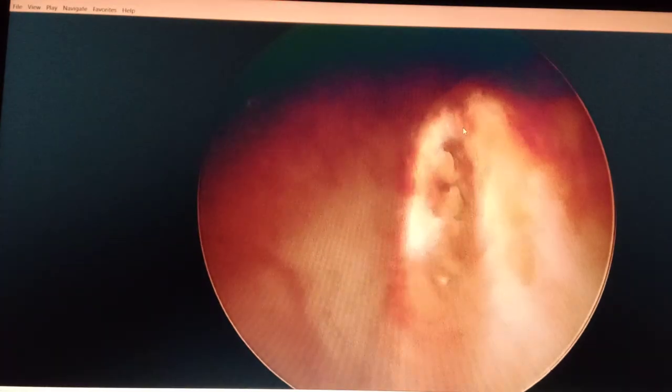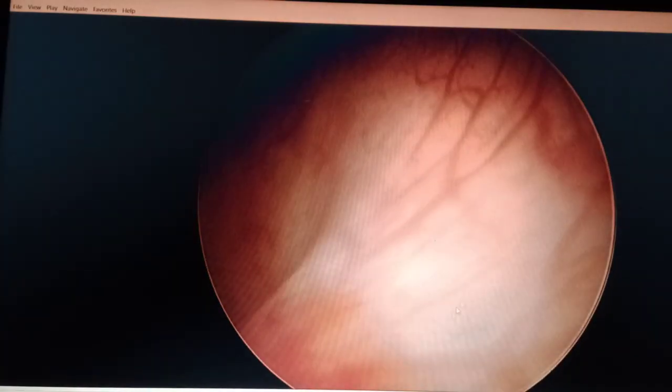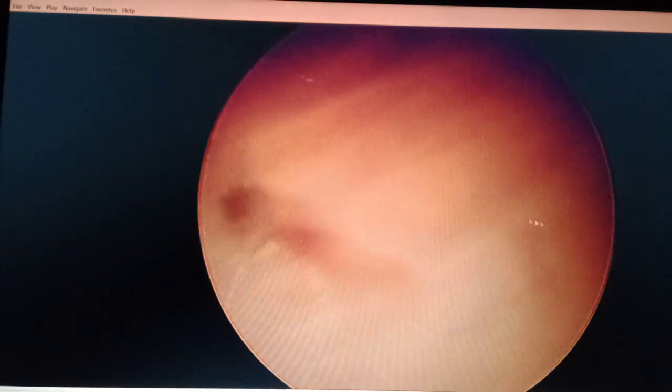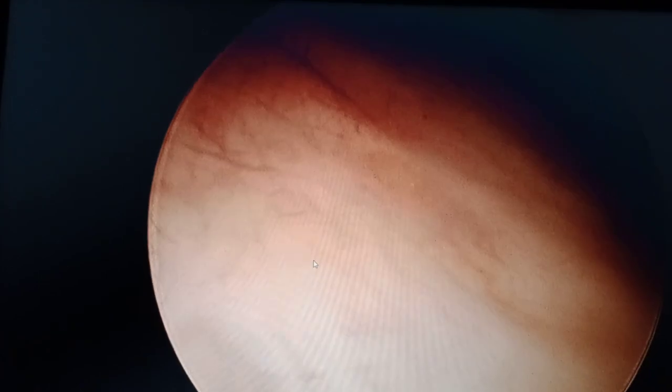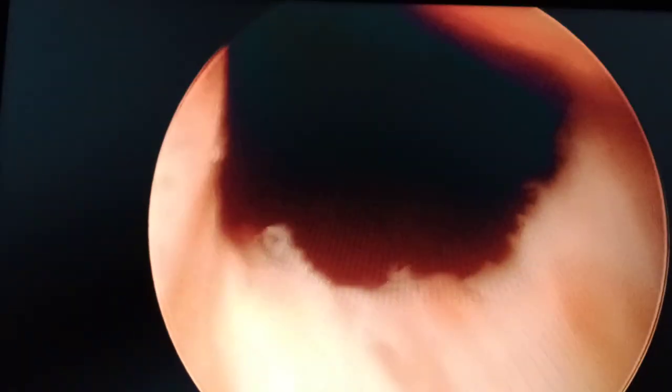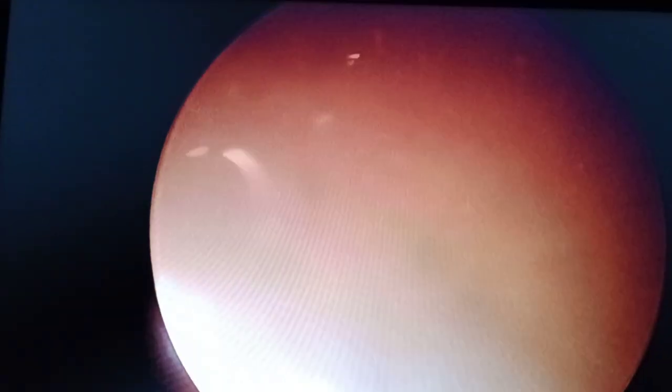This is the ureteric opening — the projected, dilated one. Just for reference, here is the left trigonal ridge, and here is the right ureteric orifice. This one is the bladder neck. You can see the flakes coming out; I am just waiting for a time being to let it clear off. You can collect it and also send it for culture.